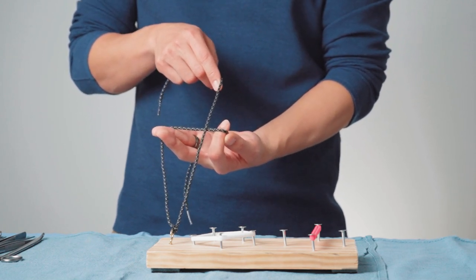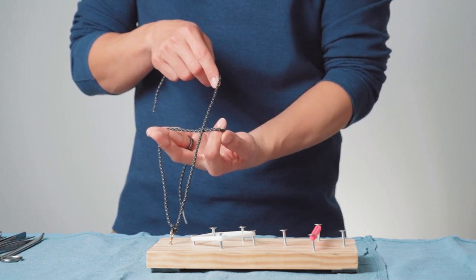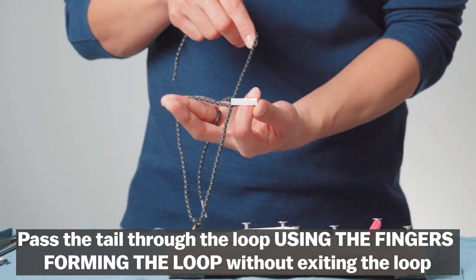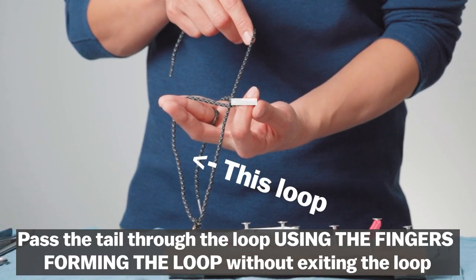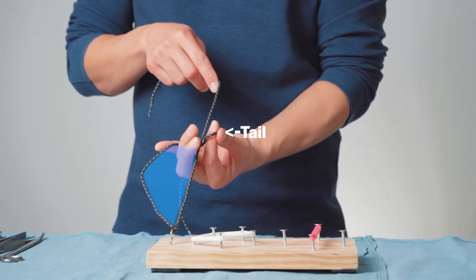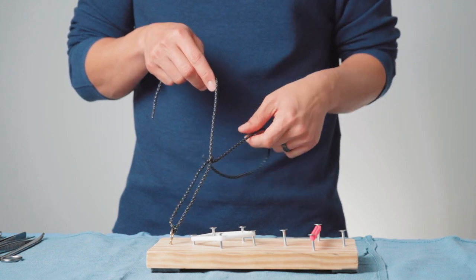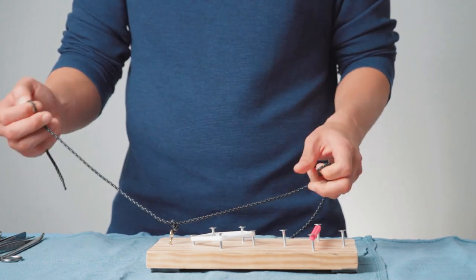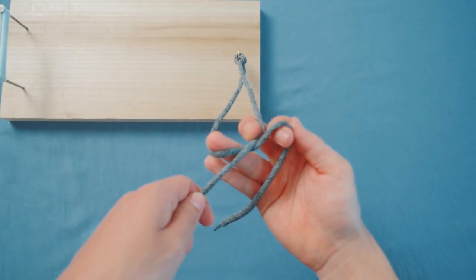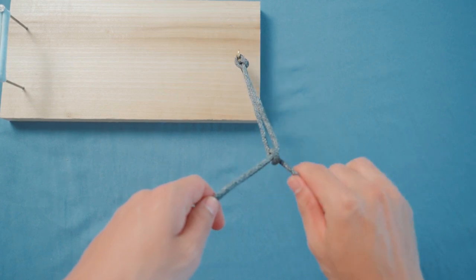Once you're able to set up the loop and you have your fingers going through the loop, the rest is very straightforward. All you have to do is think about pulling this tail through that loop using the two fingers that are inside of it. The motion for the backhand is: you bend those fingers, you grab that tail, and then you rotate your wrist out as you're pulling the suture through. To show you that motion again — you create the loop, you have your two fingers grab the tail, and then pull it out through that loop.